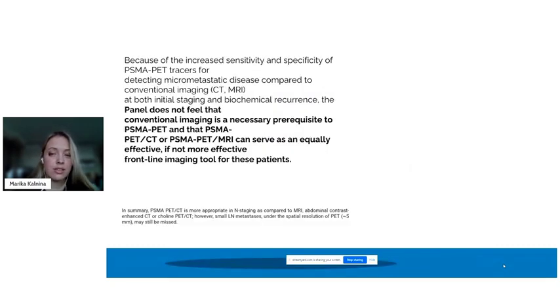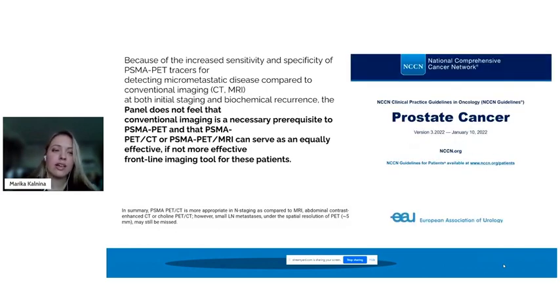And last year, it was a big step for nuclear medicine in prostate cancer diagnosis, because the National Comprehensive Cancer Network guidelines stated that the panel does not feel that conventional imaging is a necessary prerequisite to PSMA PET, and that PSMA PET or PSMA PET MR can serve as an equally effective, if not more effective, frontline imaging tool for these patients.